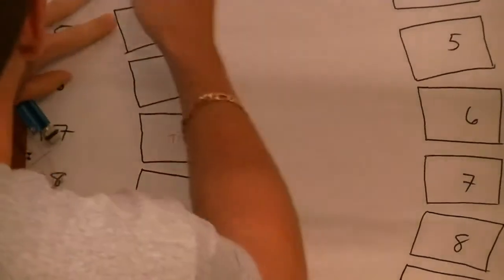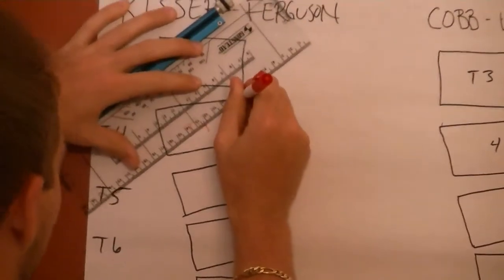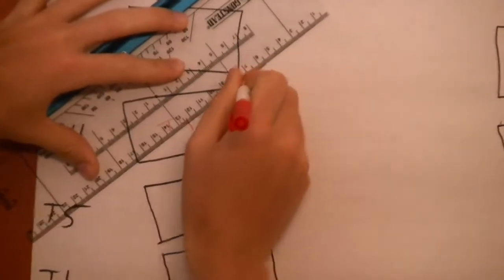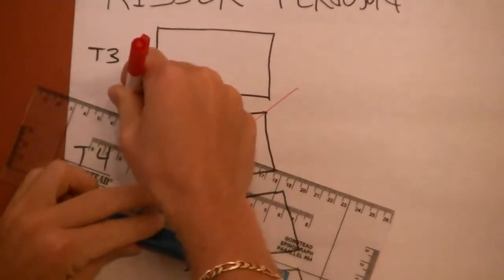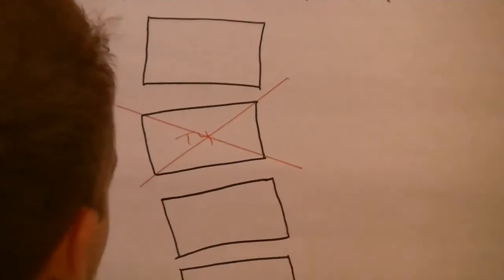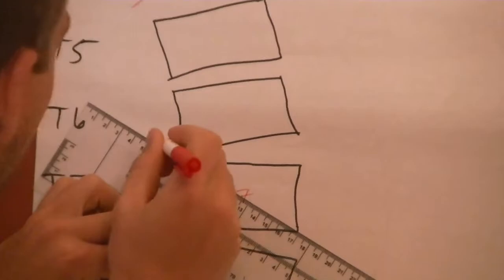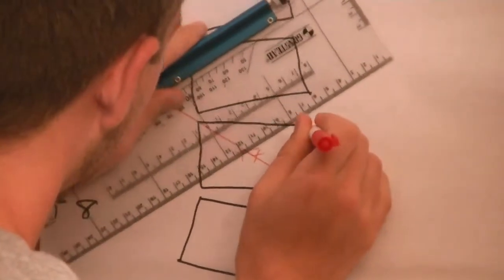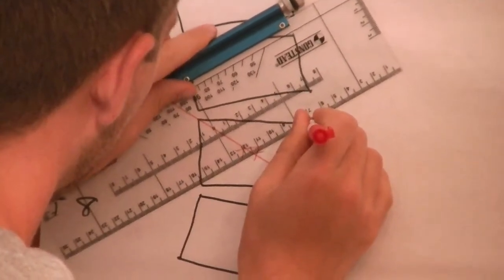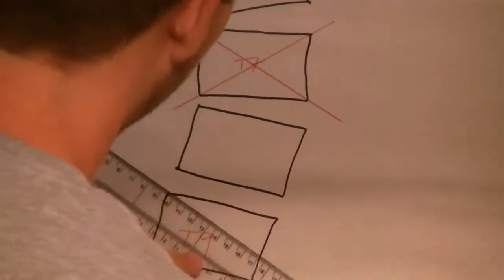Here we'll measure it out at the end. We're going to cross-check across the vertebra. Do the same thing at T7. What we're trying to do is find a center point for each vertebra. And we'll do it at T9.